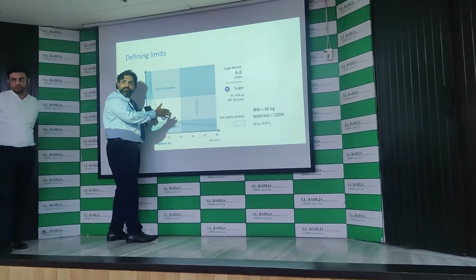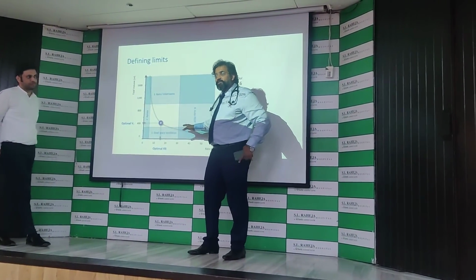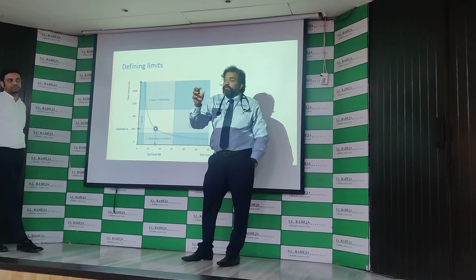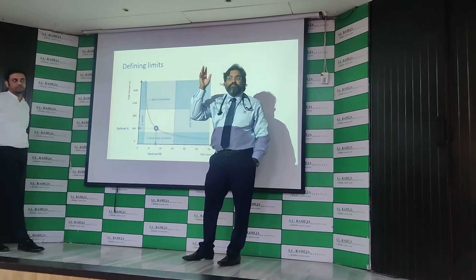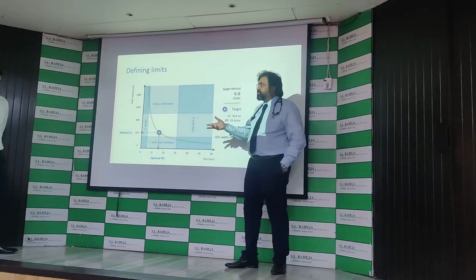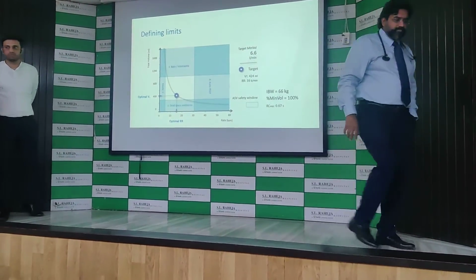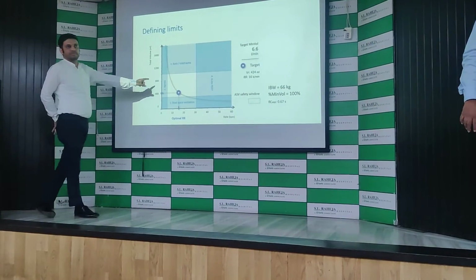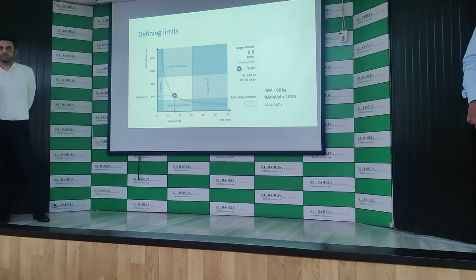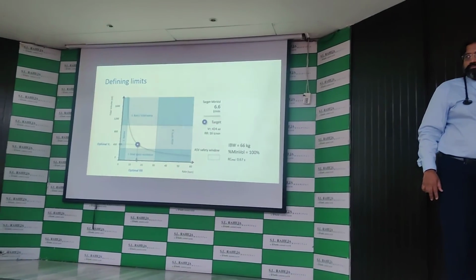So the safety box will stay there only, and the target only will move out. That is what I asked him, how frequently it is actually doing the breath. That will probably change the box. What she's asking is, does the box change? The box will change only on the basis of the time constant and the lung condition. But if there is auto-PEEP gradually all the time, the box should not change, the target will change. The box will change.